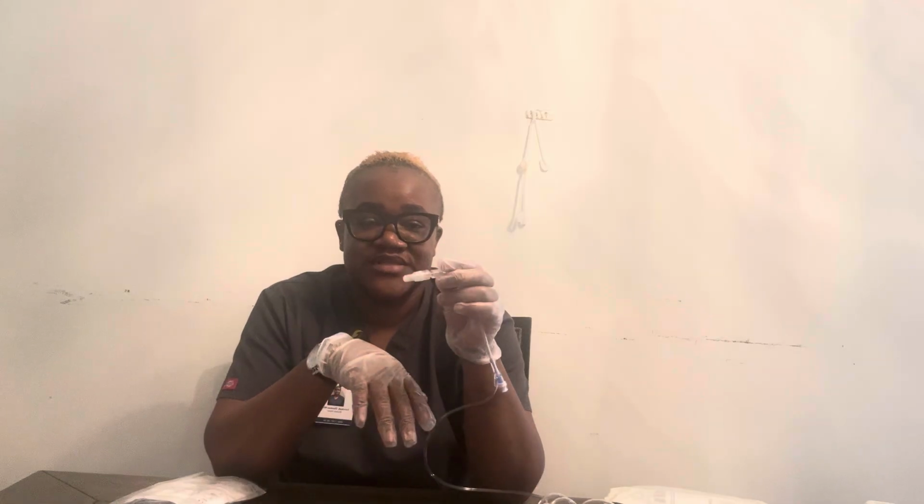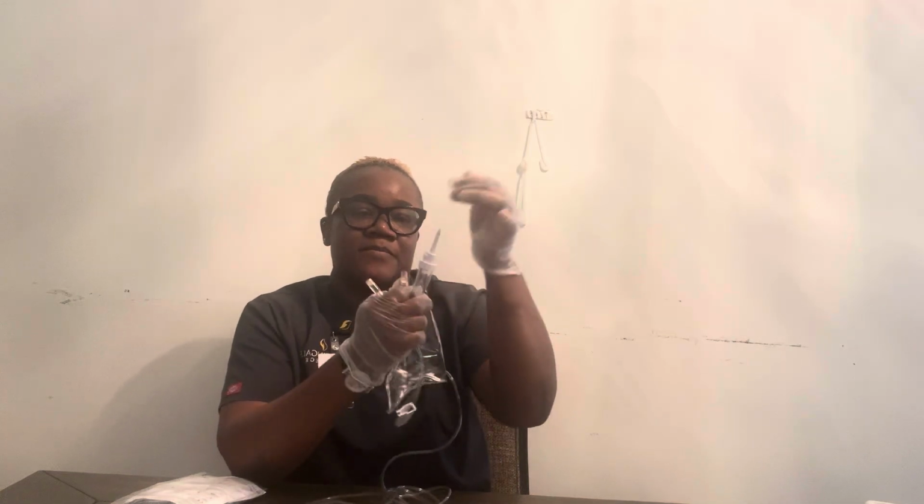And finally we have the adapter end, and this is the end that is connected to the patient's IV site. So I am going to spike my bag. I have to first start off by removing this cap from the fluid. Next, I'm going to remove the top of my spike, and then I'm going to spike my bag.